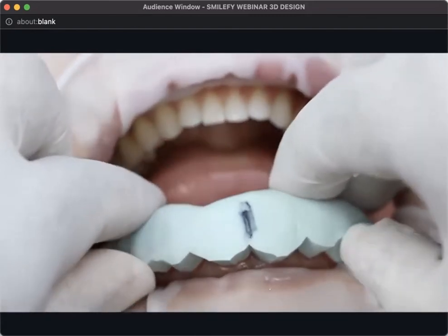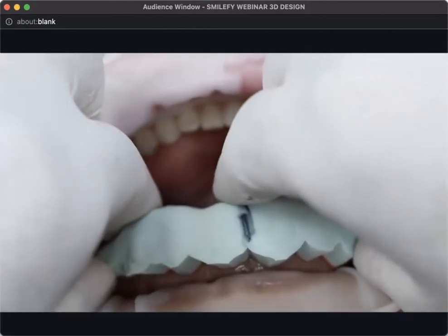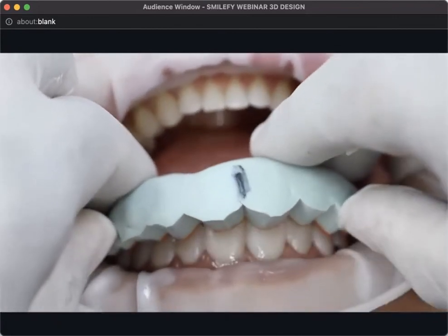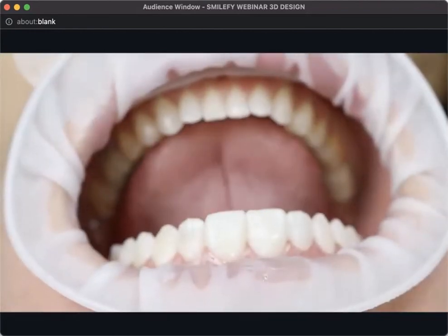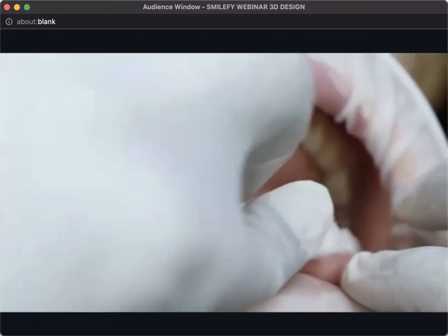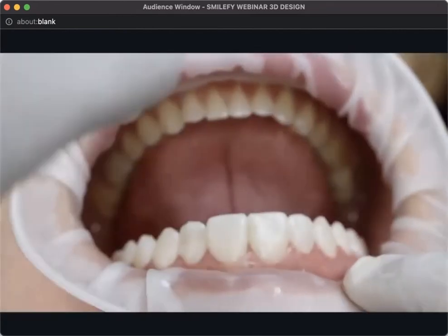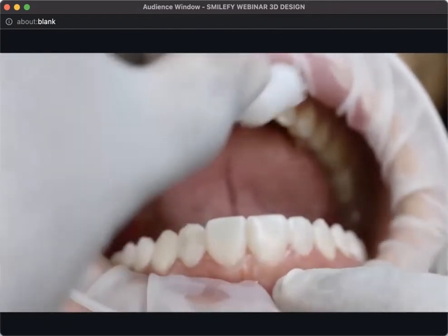This is gold, you guys. Doing this type of workflow is gold in your practice. You will have less headache because your patient is involved. You can get your patient's consent by writing the form. Take a picture, just take a look at the mock-up itself. You get an alcohol 70%, and look how shiny it looks, how great it looks. The one that I used is Luxatemp for this case.